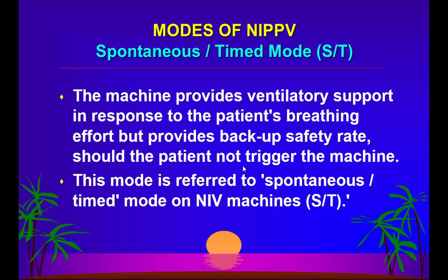So what is basically NIV is made for those patients who can breathe spontaneously, adequately, appropriately, a little bit, right? Not the patients who will require timed breaths, or who are hypoventilating so much that they cannot trigger the ventilator. That is very, very important. And you have the ST mode, which is like SIMV mode, right? Where you set some mandatory breaths on the ventilator, and there are some spontaneous breaths.